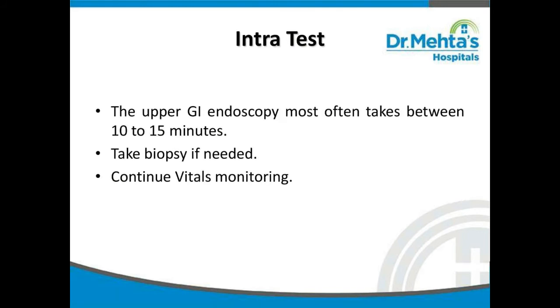The upper GI endoscopy usually takes 10 to 15 minutes. Biopsy will be taken if needed. The vital signs will be monitored continuously.